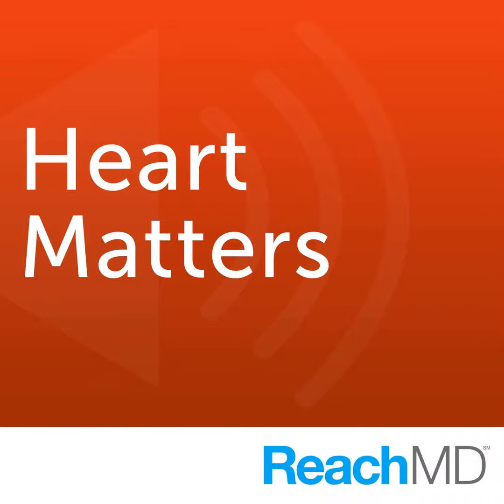So everyone's very fearful of missing someone who has a real ongoing coronary problem, and we know that mixed in with that is a lot of people with nonspecific chest pain. And the proposal here is to use a CT angiogram to help do that triage. If someone gets a CT angiogram and it's completely normal, the hypothesis is that that person is very unlikely to have an ongoing coronary disease problem, and it would be safe to just send them home and not do anything further. Whereas if they had some degree of obstruction on the CT angiogram, further tests might be warranted, including admission or other additional workup.